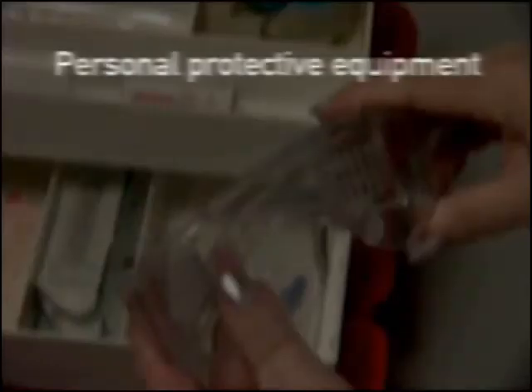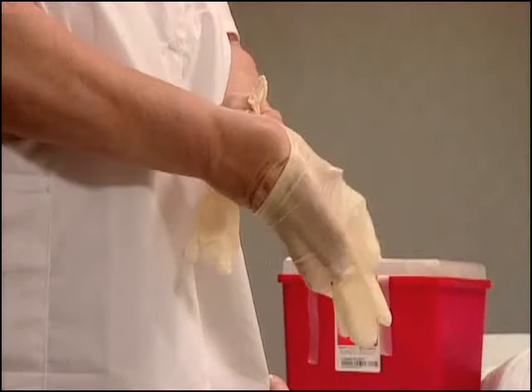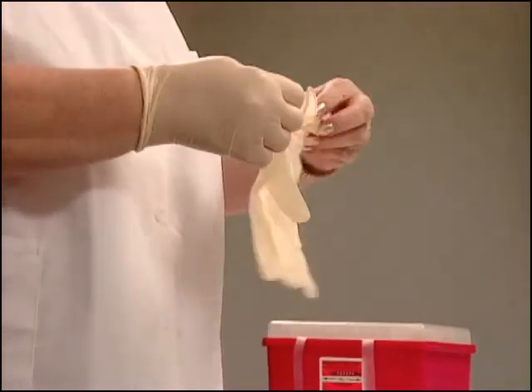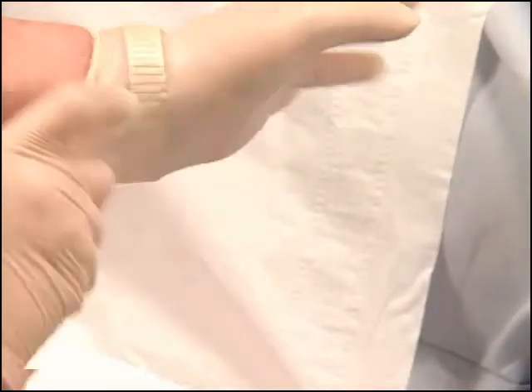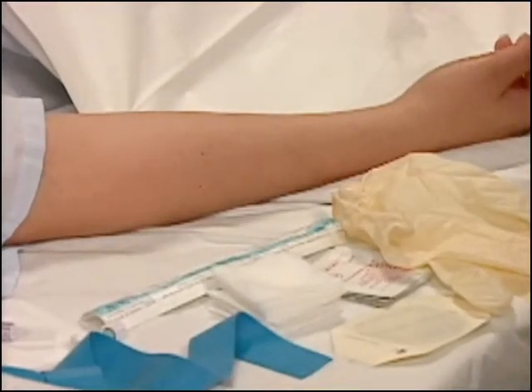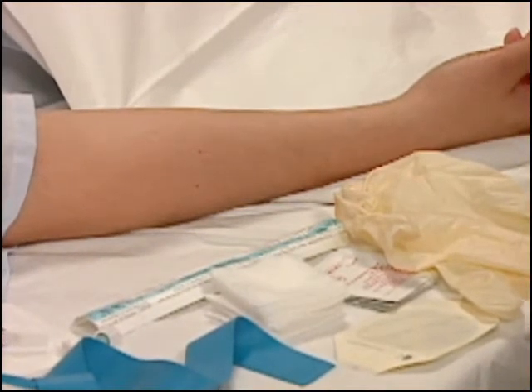Personal protective equipment such as gloves, goggles, masks, and gowns should be chosen on a case-by-case basis. Although gloves are always worn, masks and gowns may be optional in certain situations. When you are fully prepared with all the appropriate equipment, return to the patient in order to complete the procedure.